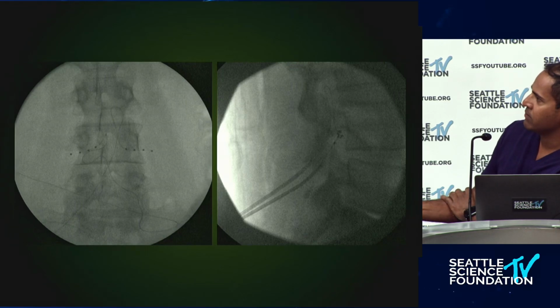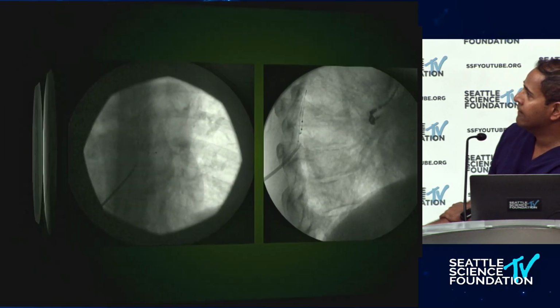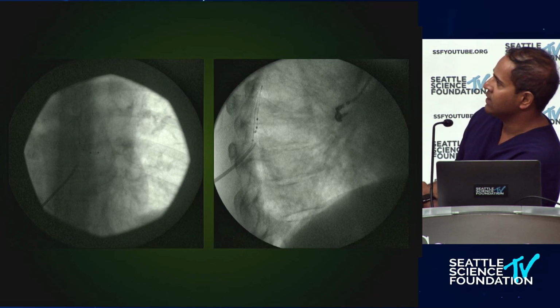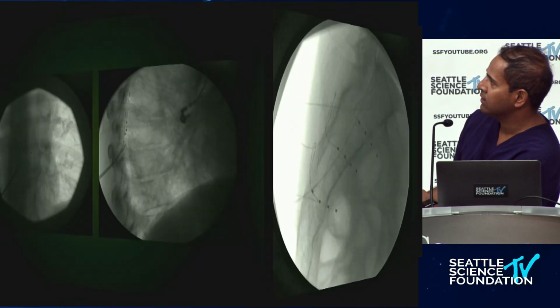So these are just some of my pictures from some of my cases, showing you bilateral placement. Here the lateral view shows us we're behind the posterior border of the vertebral body. That ensures you're at the DRG, the dorsal root ganglion. And this is just showing you some thoracic pictures of some cases. Lighting's not perfect, but you can see here, same idea. There are the Cheerios looking right at us. Nice electrode from the EKG.